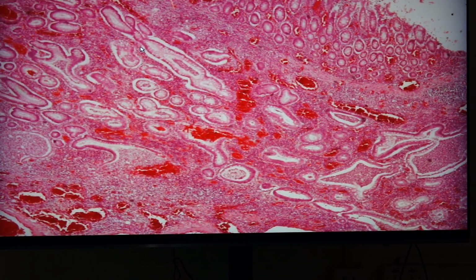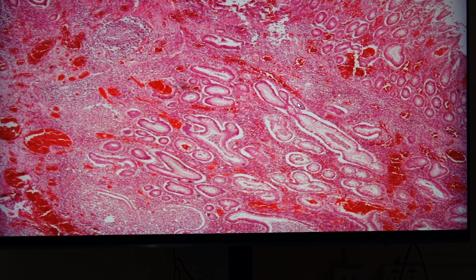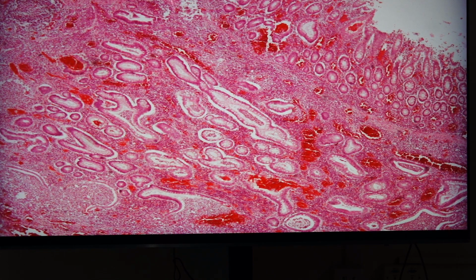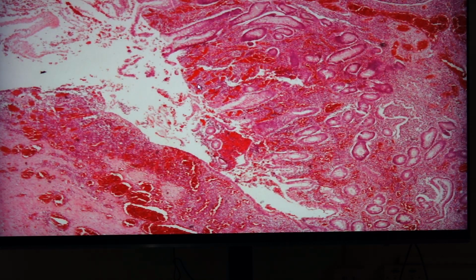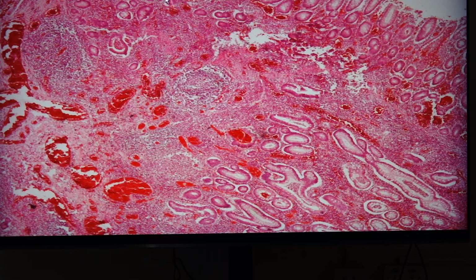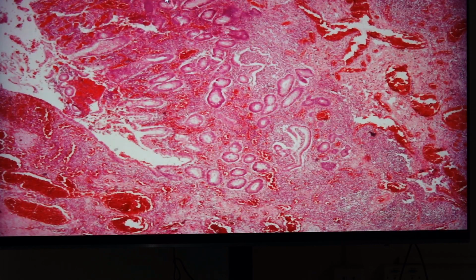Okay, here you have a very large amount of mucosal content in this particular portion, brought about by the presence of hemorrhage and inflammatory cells in the area. Okay. And the submucosa would be this one, and then the muscularis. So pseudopolypoid formation can be present. You can see the pseudopolyp here. Okay, and this is due to the intense inflammation, congestion, and edema.